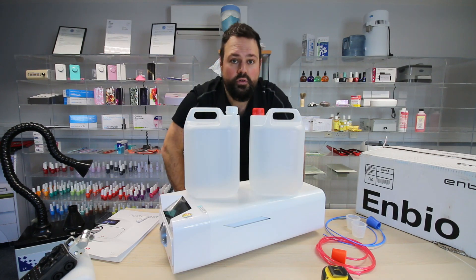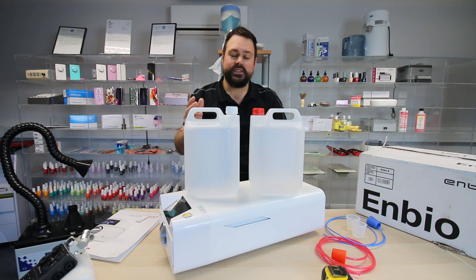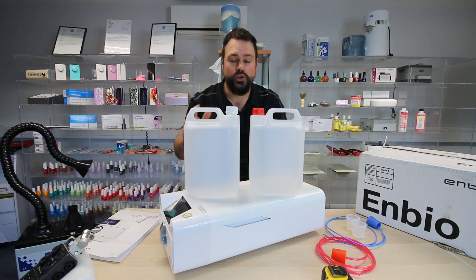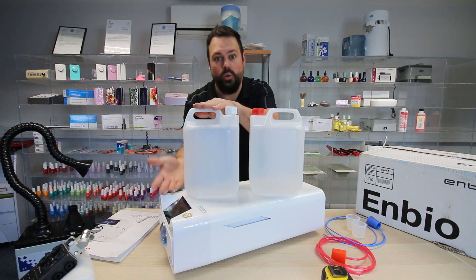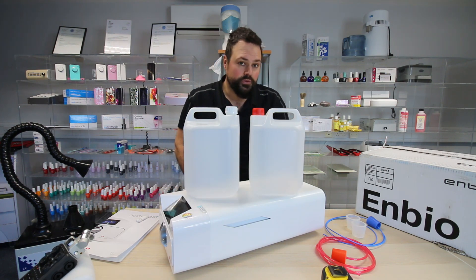People have been asking me how much water it uses. It all depends on the cycle. The 7-minute fast cycle will use a lot less water — about 150 millilitres or something like that — whereas the longer cycle will use more. It all depends on which programmes you use and how often you're running them as to how long that water will last you.